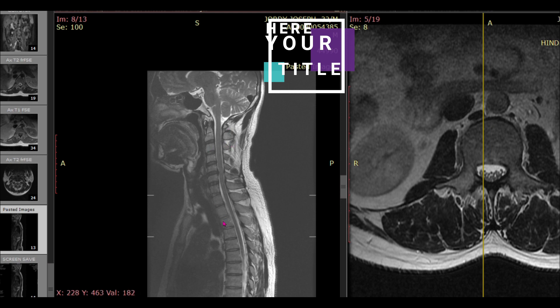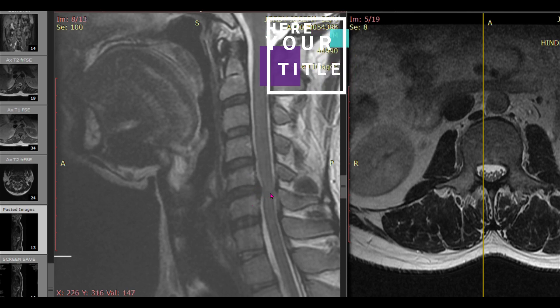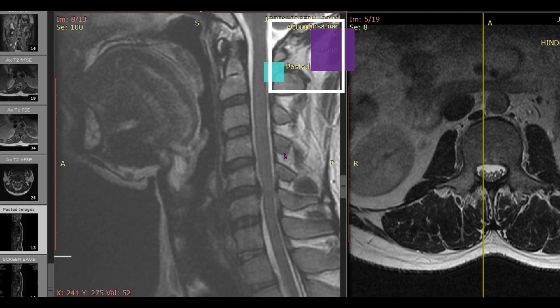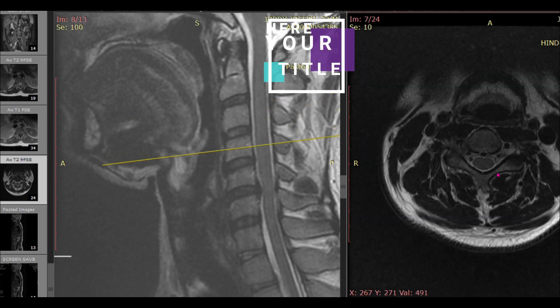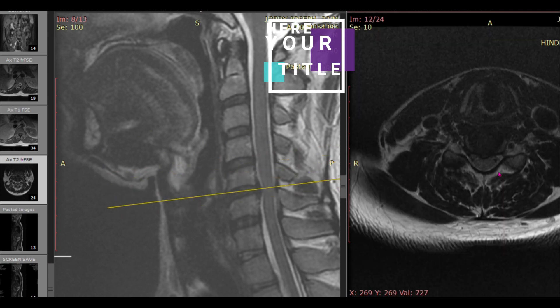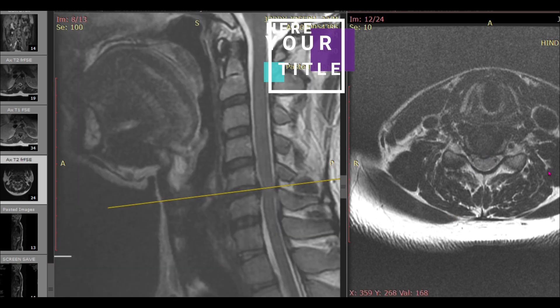In this case there was an interesting incidental finding: a slight central canal narrowing at the level of C5-C6 intervertebral disc space. This was mentioned in the report. You can also see there is some compression of the cord in this area and the signal is also a little bit altered, which may be clinically very relevant. We took the directive to do axial section imaging, and you can see very clearly there is significant narrowing, with the posterior part of the disc compressing the cord.